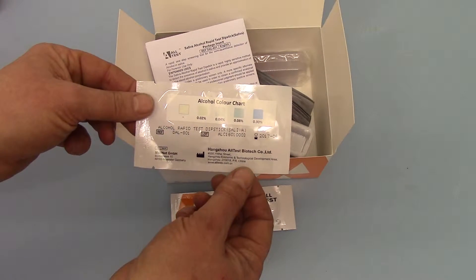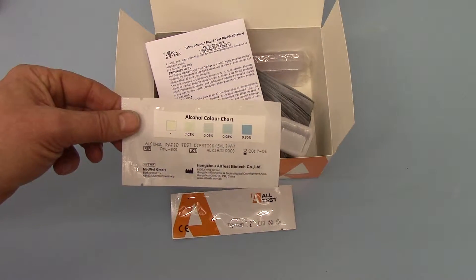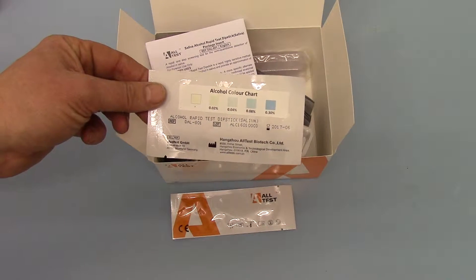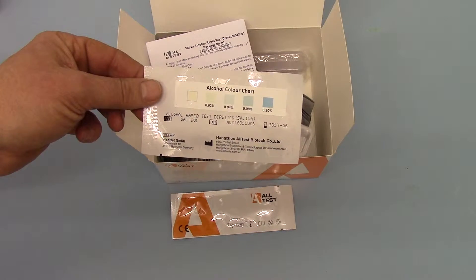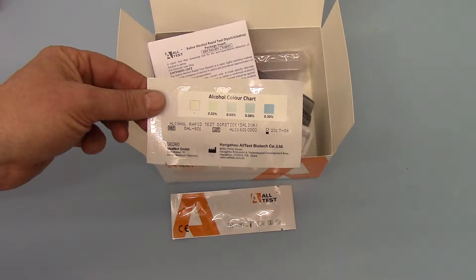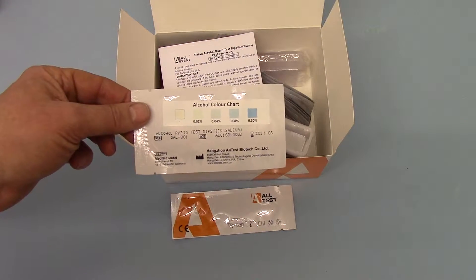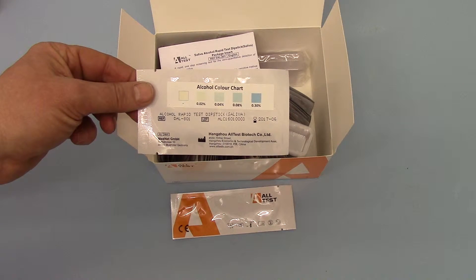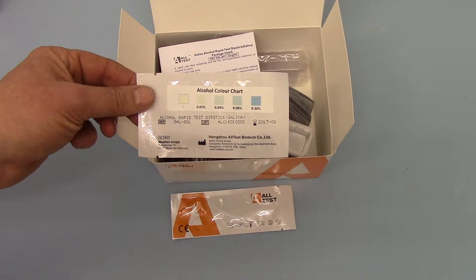Now, these are only effective if the strip is used in human saliva. What many places tend to do with these is use them in other fluids, particularly pop bottles, where you're looking for the detection of any alcohol — and there you are looking for any bluish or duck egg discolouration on the pad.